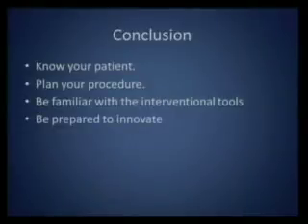So in conclusion, always know your patient. Know what you want to do. What is your target zone? What do you want to achieve? Have a plan. How do you want to achieve it? Are you doing a diagnostic angio? Are you doing some intervention? If you're doing intervention, do you think you have the right access site? Do you have the right equipment that you need to know? Be familiar with the interventional tools, because it makes a difference once you get access.